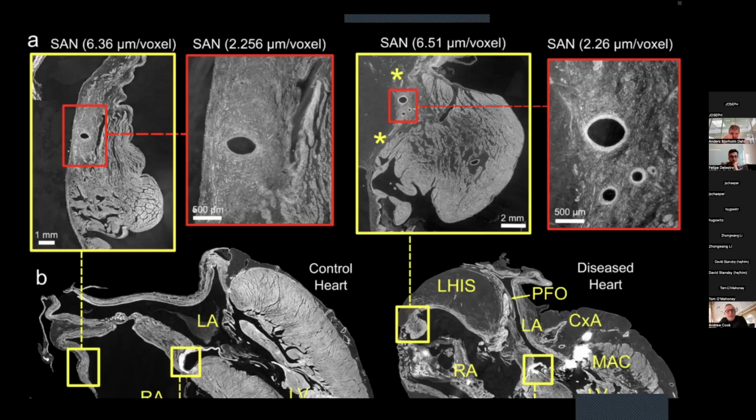But I think you'll appreciate that it's quite a challenge, perhaps, to recognize this area, other than by manual segmentation. At least it is for us at the minute. And the additional challenge, of course, is that when you get abnormalities like fatty infiltration, you lose a little bit of that density of the cells around the SA nodal artery. So, it's fine recognizing normality, but then you've got to be able to apply the same techniques, or similar techniques, to abnormal situations.